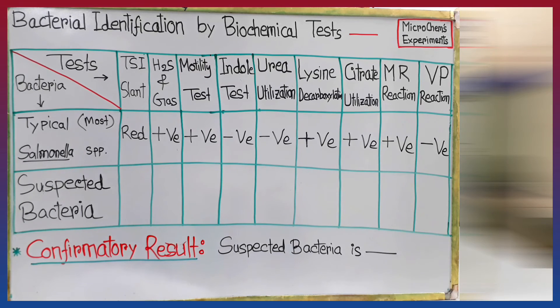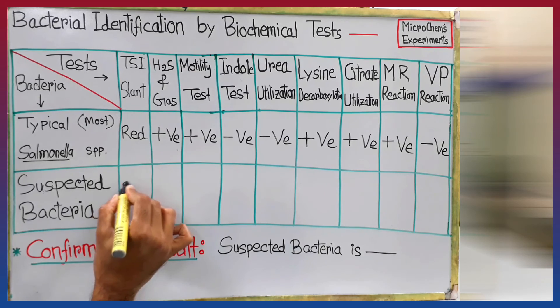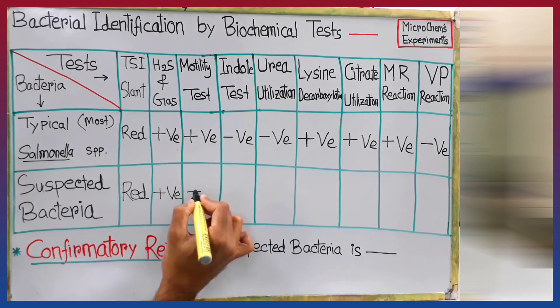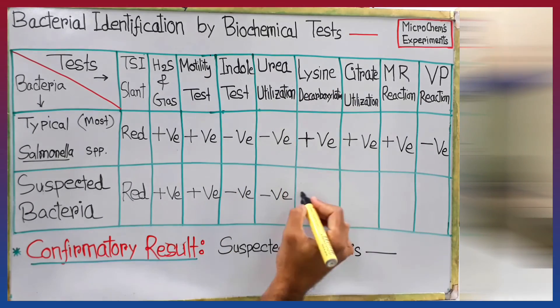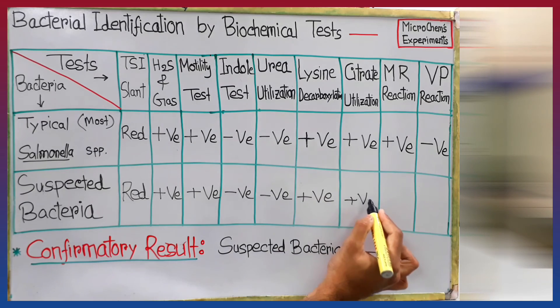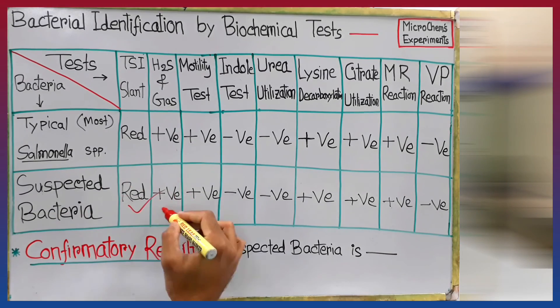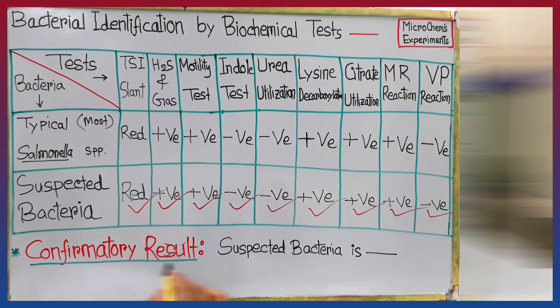Now it's time to interpret the biochemical test results. The first row shows different biochemical test names and the left column shows the bacteria name. Our tested bacteria formed a red TSI slant, were positive for hydrogen sulfide and gas production, positive for motility, negative for indole and urea, positive for lysine decarboxylation, citrate utilization, and methyl red reaction, and negative for VP reaction. All test results of our tested bacteria match the reference results of typical Salmonella species, so we can confirm that the suspected bacteria is Salmonella species.